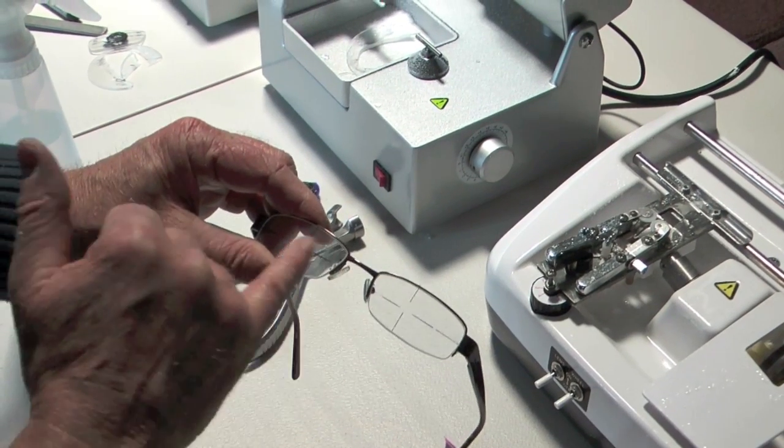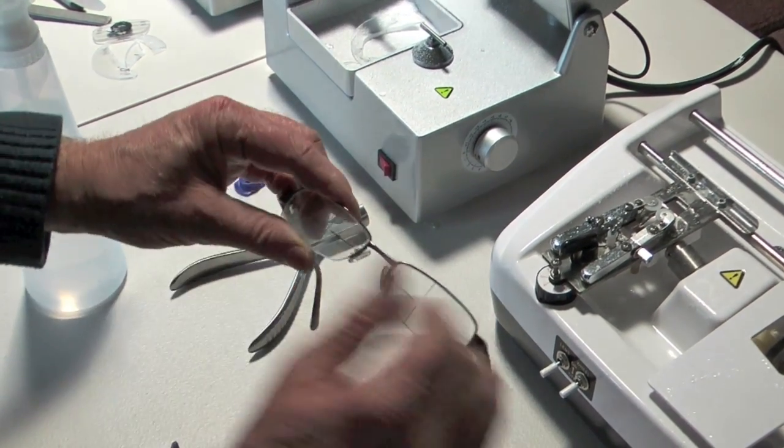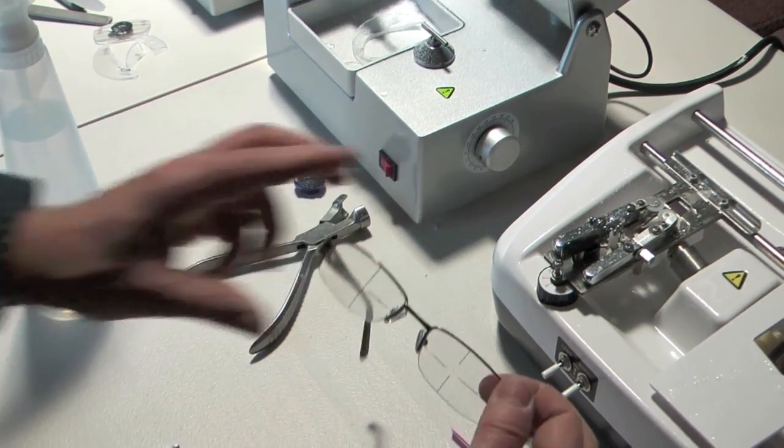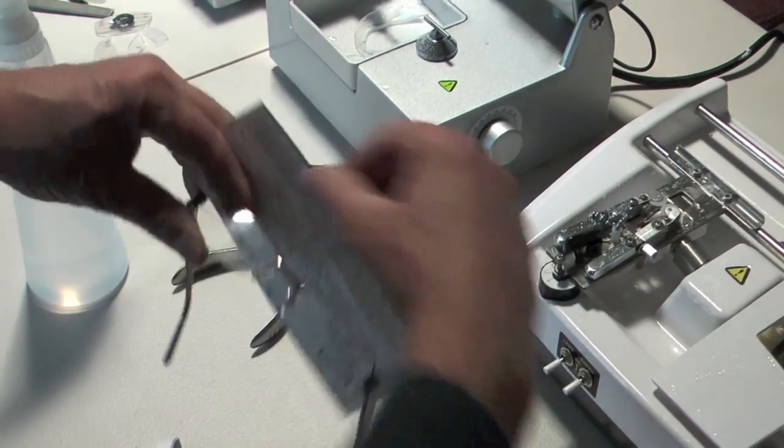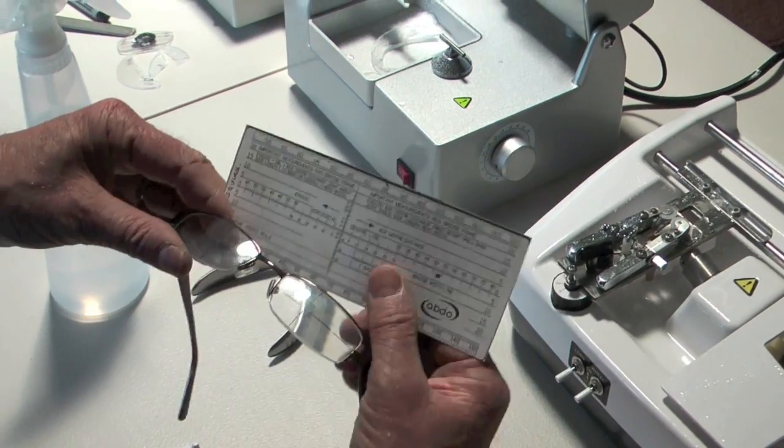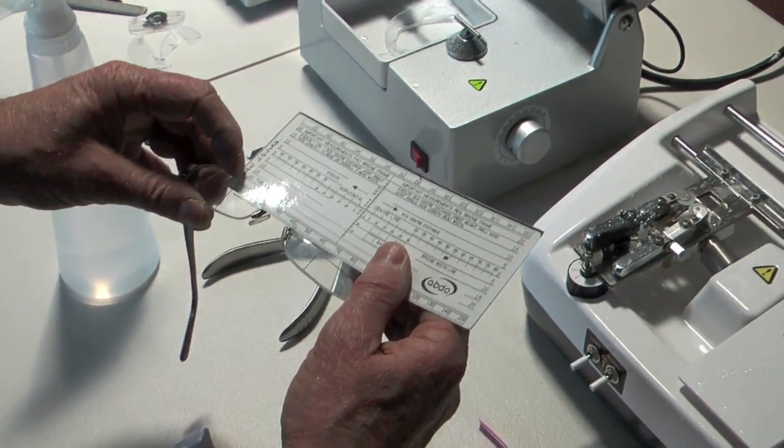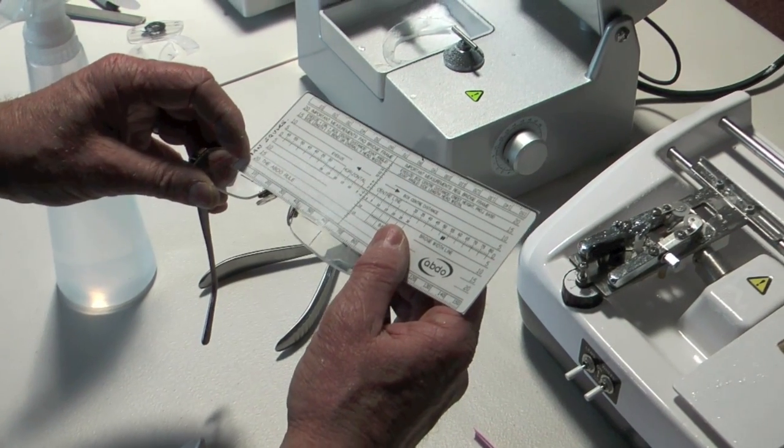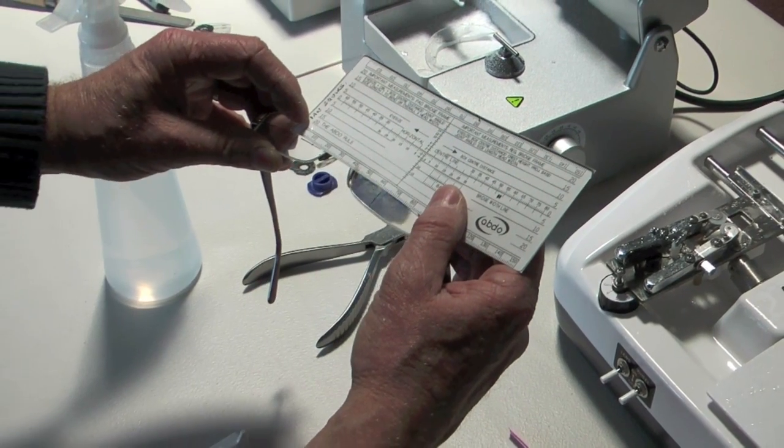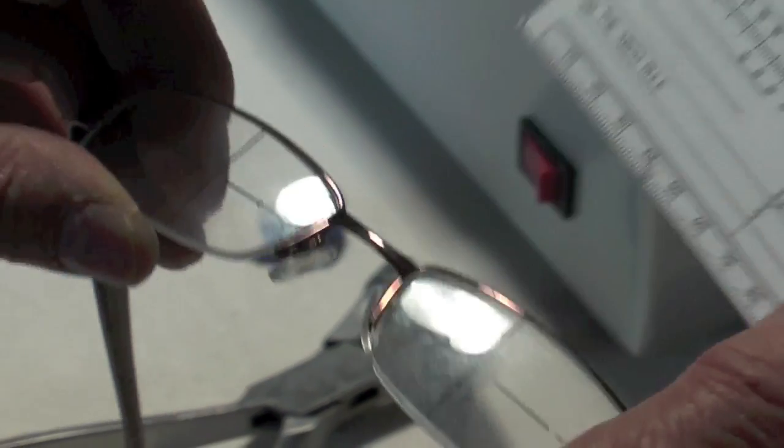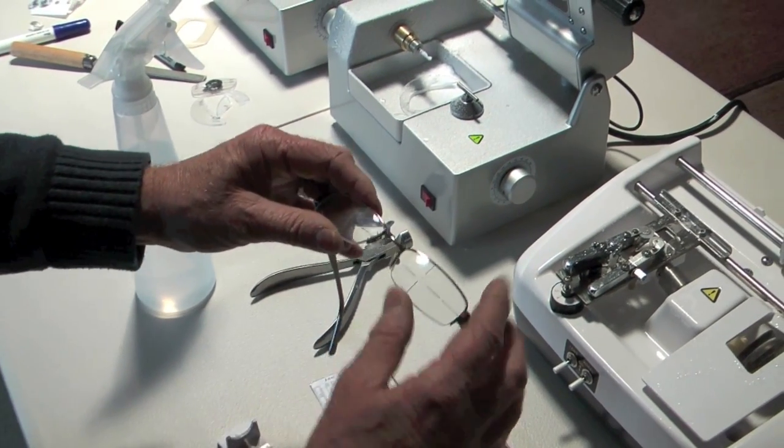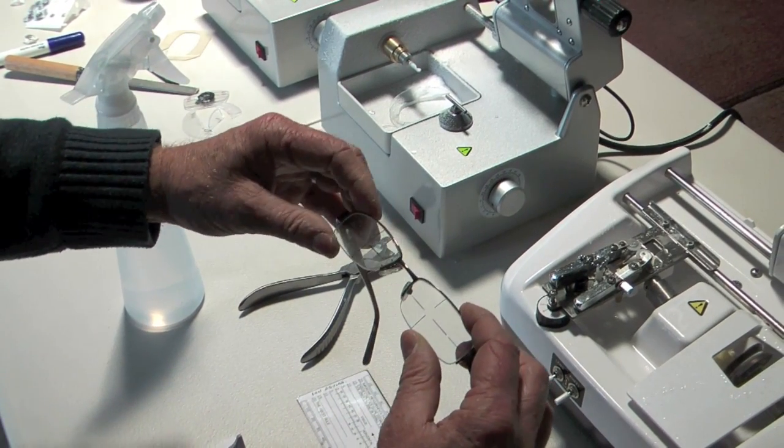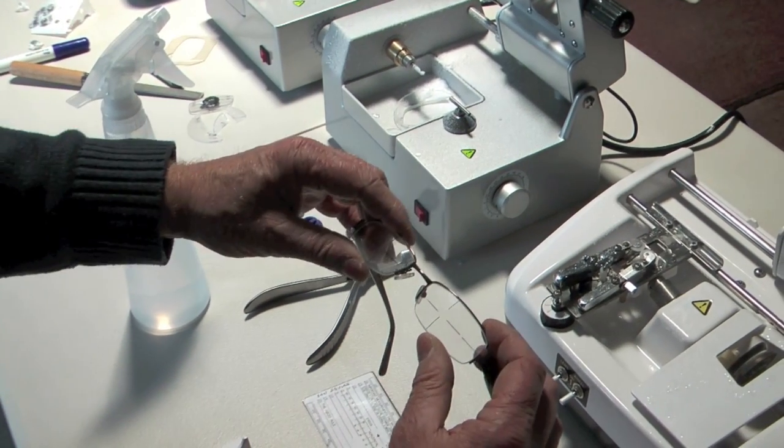Now the distance between these two lines should match the PD, which should be 62mm or thereabouts. Remember that we de-centered the lenses. So we've got there and it's actually about 61. But that's very good. I mean that doesn't matter too much. One millimeter is fine. So what we're going to do now is I'm going to clean the lenses and then we're going to see what the prescription is to make sure that it's accurate to what we wanted.